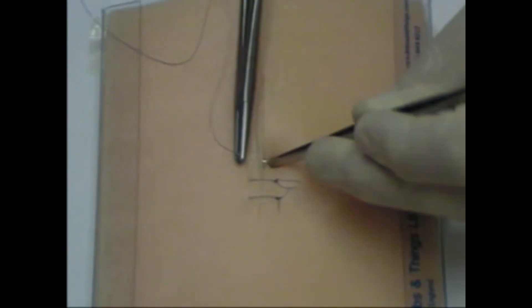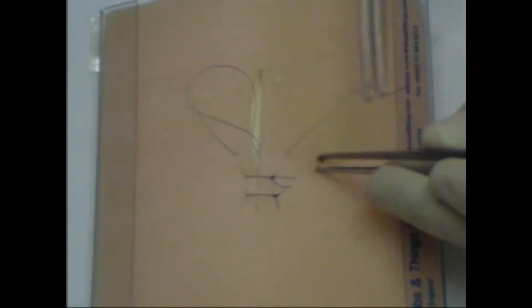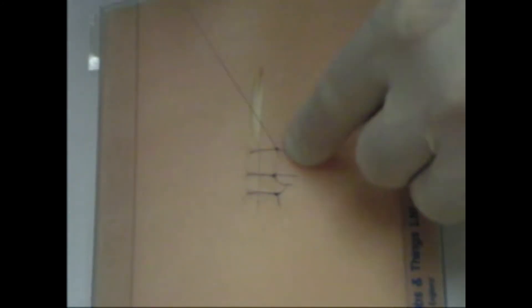In simple skin suturing, the needle is inserted vertically, emerging at the deepest point of the wound. It is then placed deeply to emerge through the skin symmetrically with the first side. Monofilament nylon is often used. Training surgeons initially tend to place their sutures too close to the skin edge and too superficially.